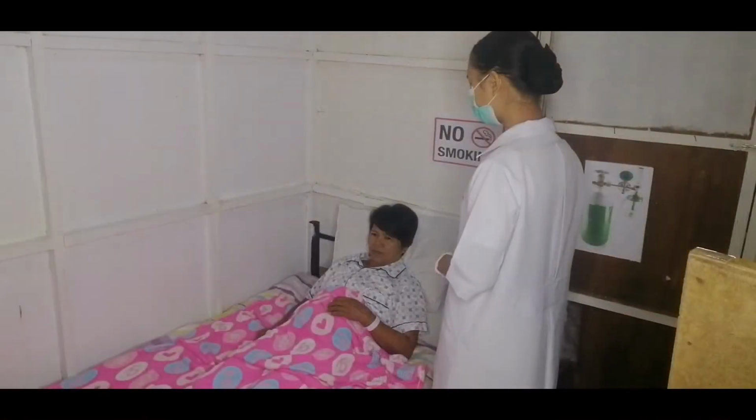Review safety precautions necessary when oxygen is in use. Then place no smoking signs to the appropriate areas. Then, identify the patient. Good day, ma'am.